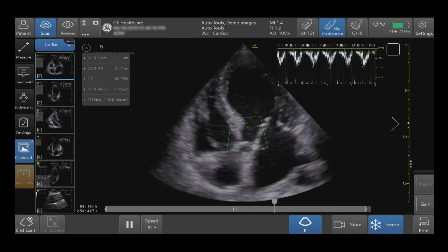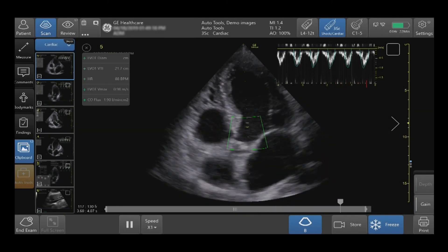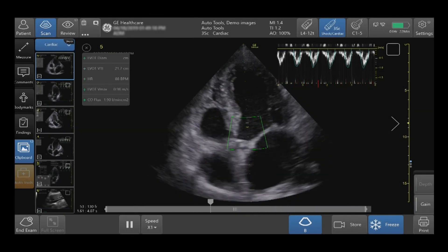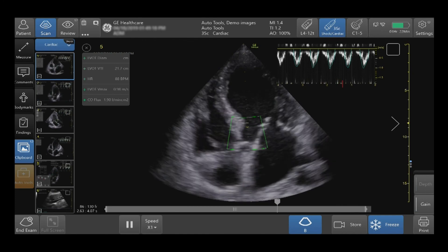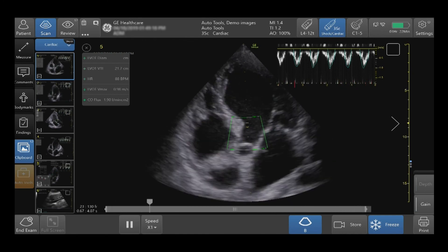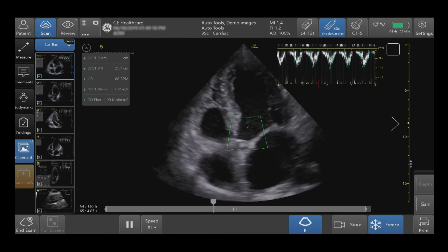The Shock Toolkit enables you to quickly get the information you need to make fast decisions when triaging patients in medical shock.